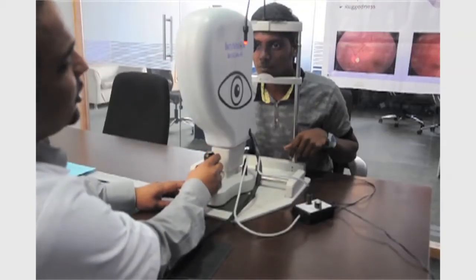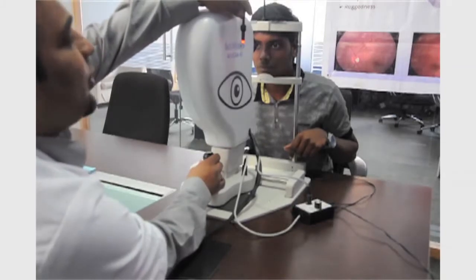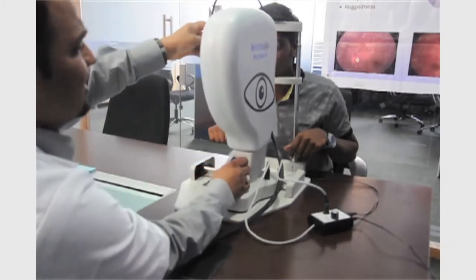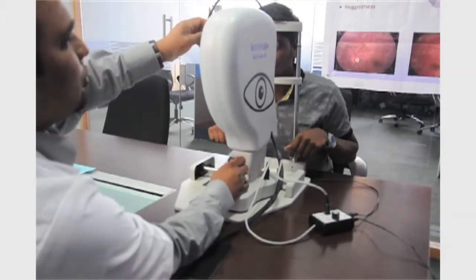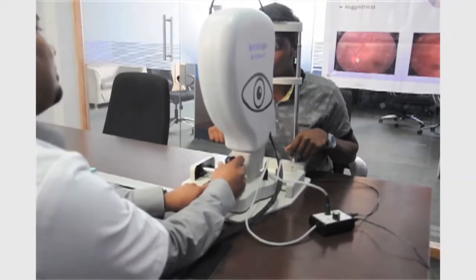Now I just captured the right eye. What I will do now is capture the left eye as well. So I will move the external fixation light onto the other side of the device. Ask the patient to see the external fixation light with his right eye and capture the left eye.